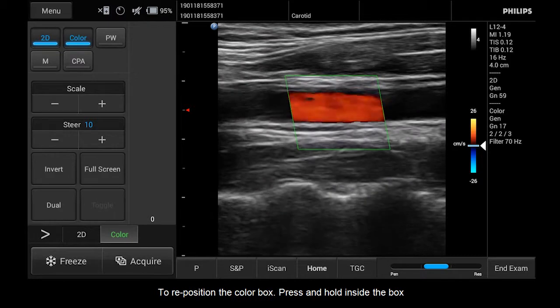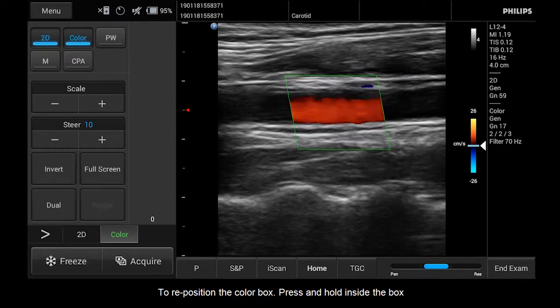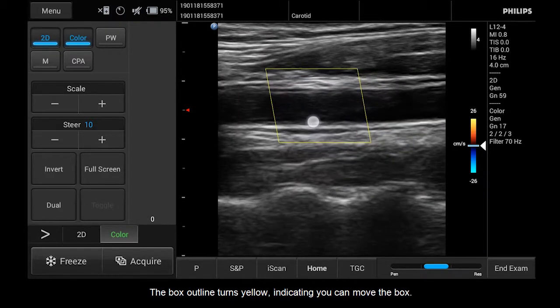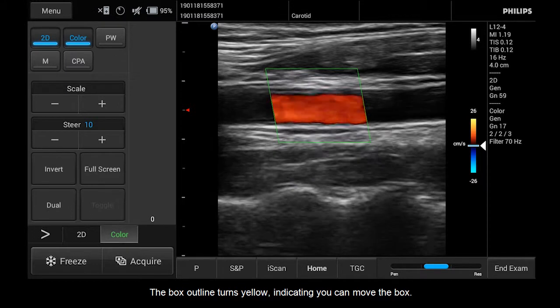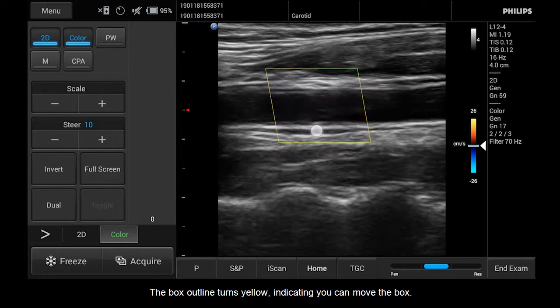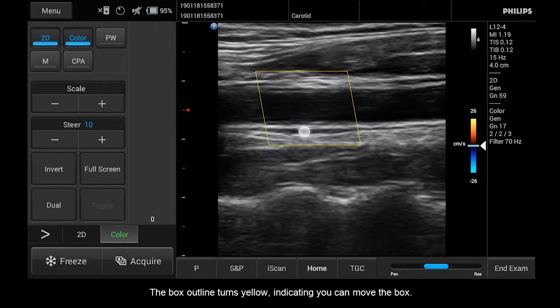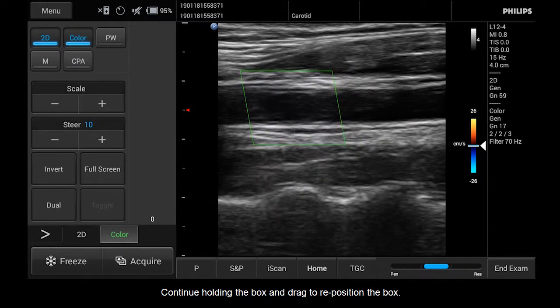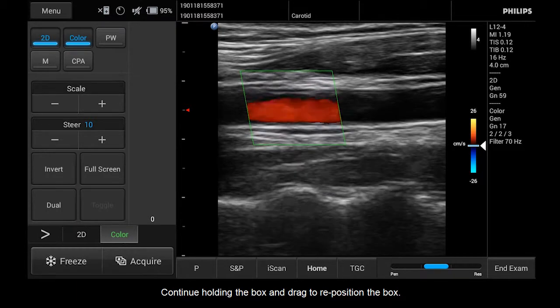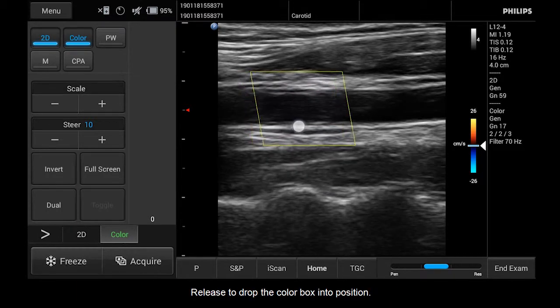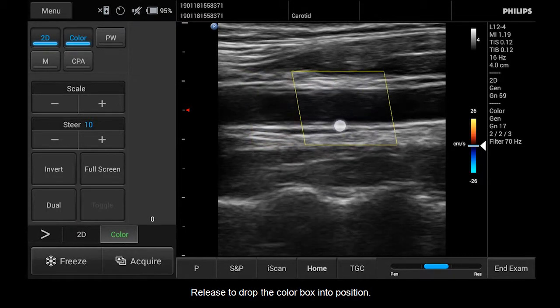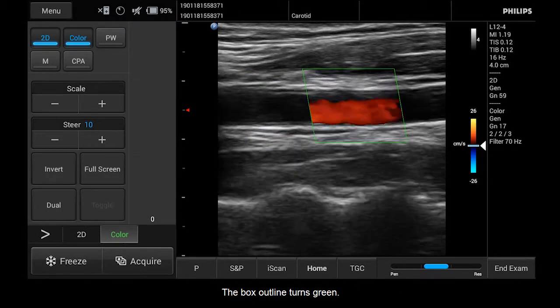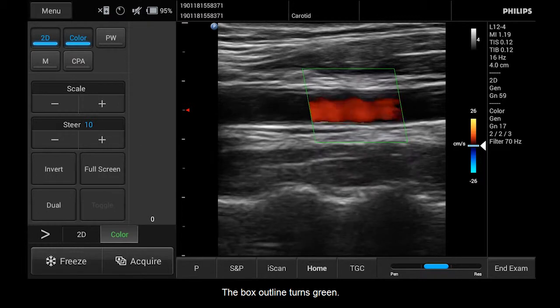To reposition the color box, press and hold inside the box. The box outline turns yellow, indicating you can move the box. Continue holding the box and drag to reposition it. Release to drop the color box into position. The box outline turns green.